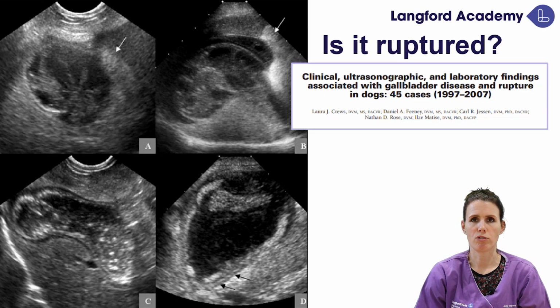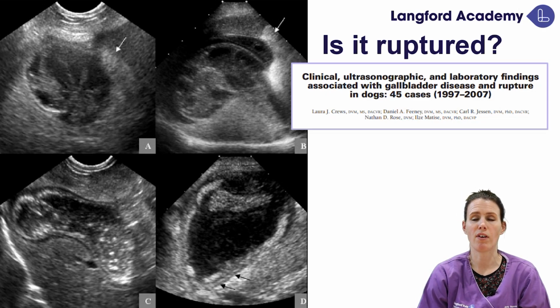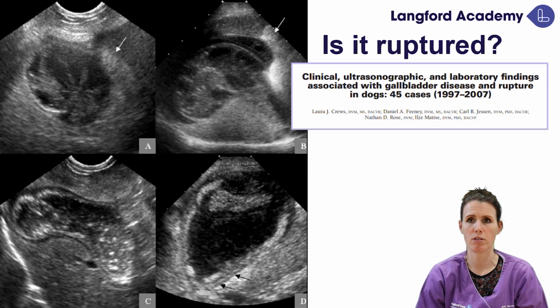People have explored contrast-enhanced ultrasonography to see whether this is more accurate, and certainly this is a more sensitive means of determining whether or not there's biliary rupture, but the lack of availability and expense of the contrast means this isn't classically pursued at the moment.